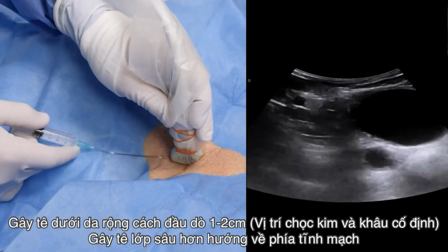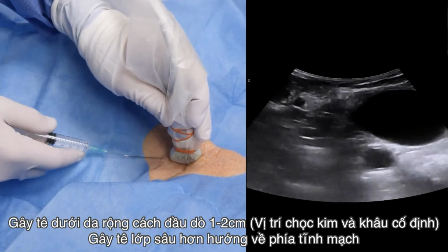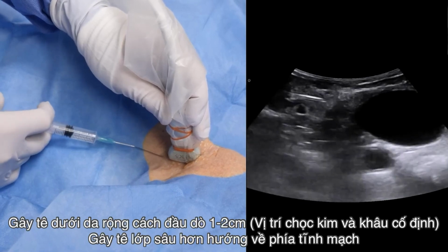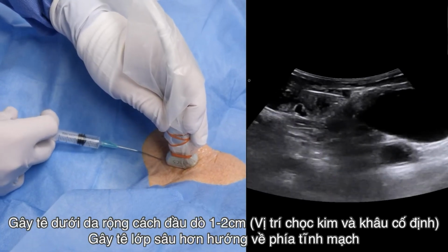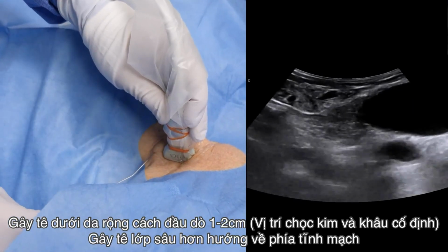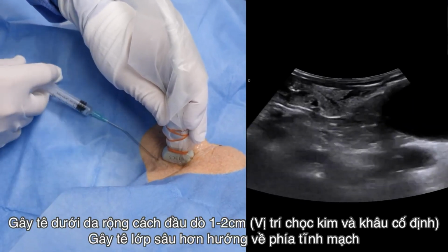Inject local anesthetics superficially a few centimeters from the probe. Make sure to cover the point of cannulation and where the sutures will go. Then inject towards the vein. In this case, a bent needle was used to accommodate the patient's anatomy, but this is generally not required.